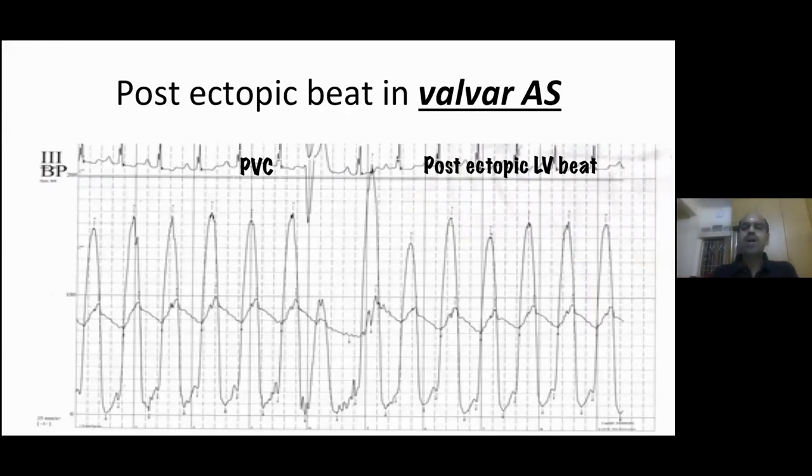Now we will go into left ventricular outflow tract obstruction at subvalvular level, wherein hemodynamics are of significance. Before understanding subvalvular aortic stenosis, let us assume what is valvular aortic stenosis. This is a patient with valvular aortic stenosis, LV trace and aortic trace.